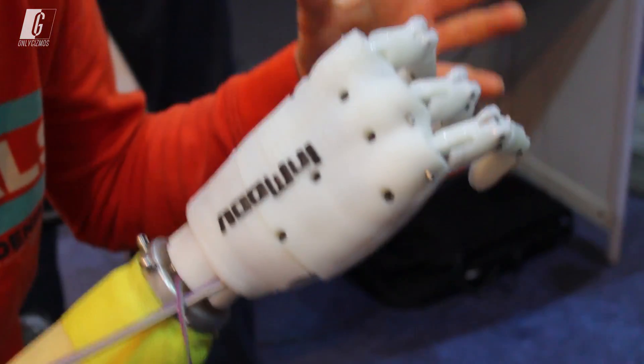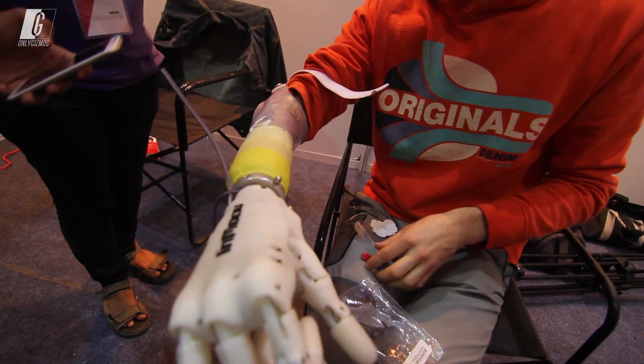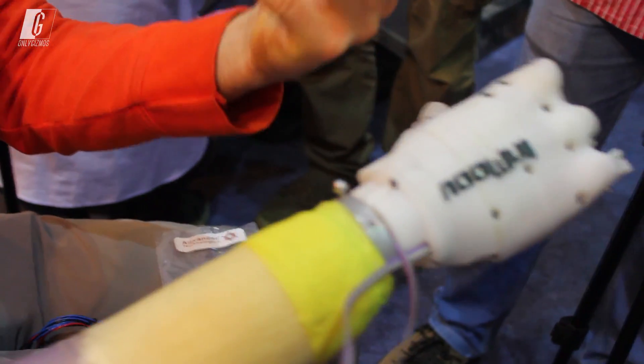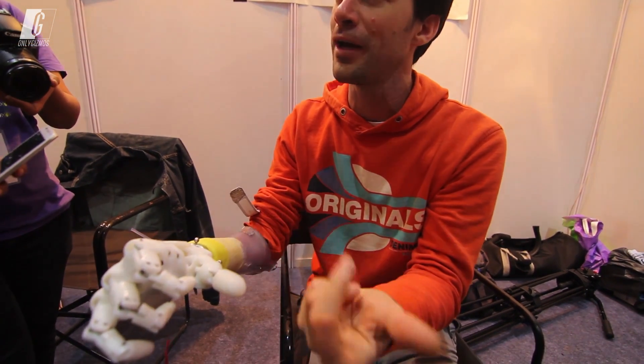The hand is 3D printed. This is a muscle sensor, so this is plugged onto this, and then it's plugged into the amplifier, and it becomes electricity. So the muscle activity is converted into electricity, and then you can use electricity to control the hand.